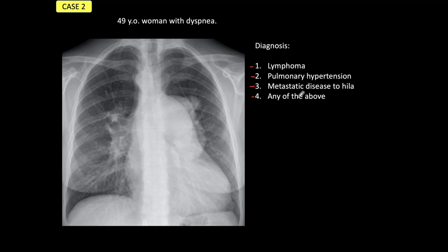Stop the presentation, study carefully the film, and then come back when you are ready with your diagnosis.